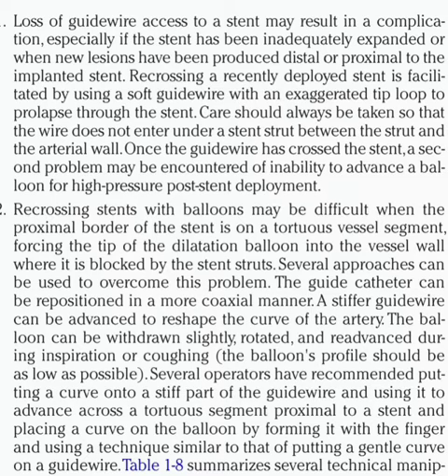Table 1-8 summarizes several technical manipulations that may be used to recross a deployed stent. Table 1-5 lists unique guidewire tip shapes that will help in difficult PCI situations.